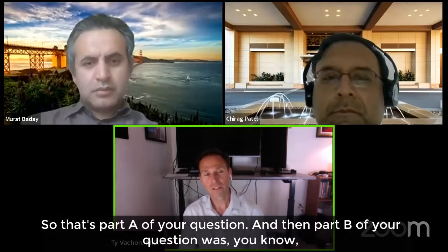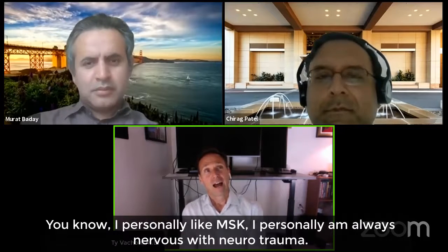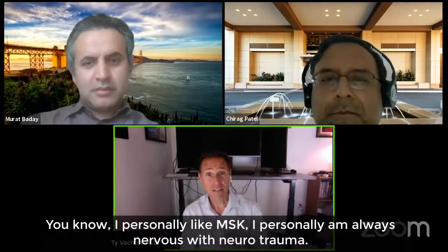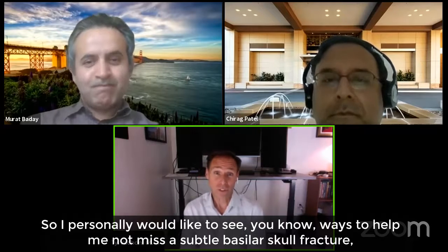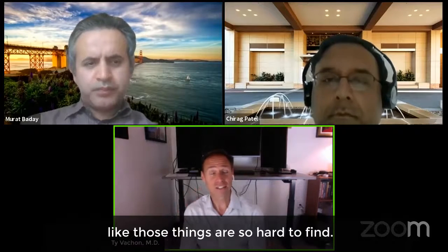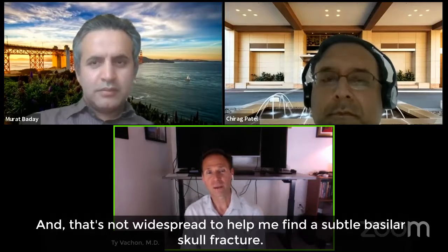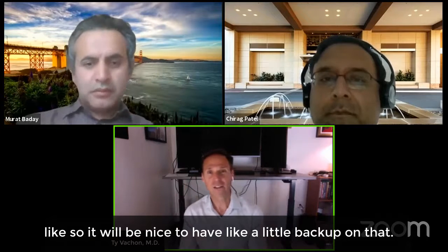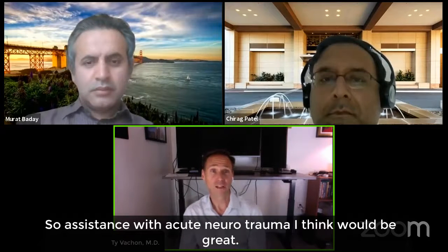And then part B of your question was, what do I see as the next need? What do we need in radiology? I personally like MSK. I personally am always nervous with neurotrauma. So I would like to see ways to help me not miss a subtle basal skull fracture. Those things are so hard to find, and that's not widespread. I know there are the telltale signs, like, do we see a effusion in the mastoids? It would be nice to have a little backup on that. So assistance with acute neurotrauma, I think, would be great.